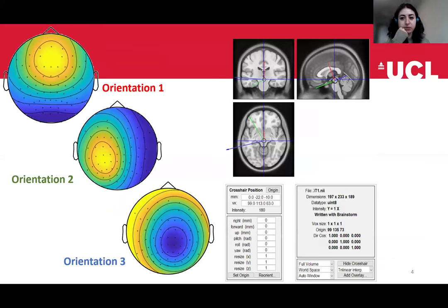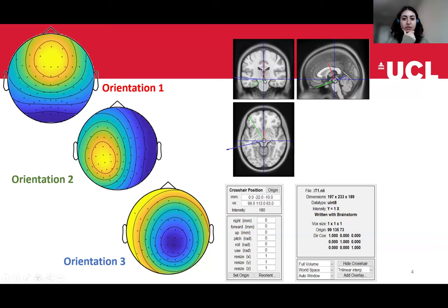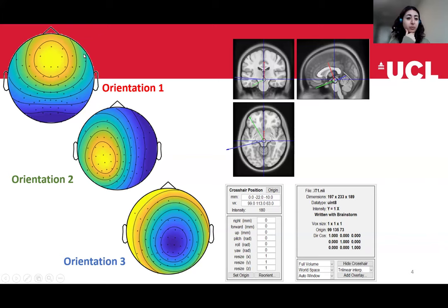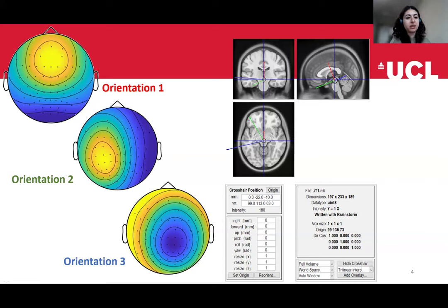To give another example of what we do in inverse modeling: I've created a dummy example where I generated some sources in the head — all in the same location somewhere deep in the head — and I generated three different types of sources. Each of them is oriented differently, so the direction of the vector with which we model the source points in a different direction. You can see that each of these different orientations generates a very different topographical map at the sensor level. This illustrates that when we do inverse modeling, we're interested in inferring three things: the orientation of our source, the amplitude, and its location.